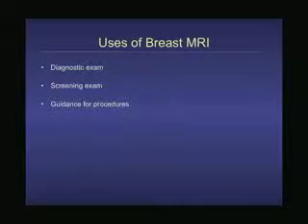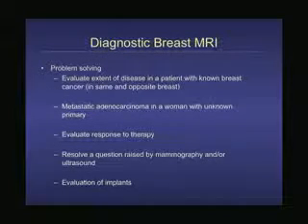So again, we use them the same ways. Number one, for diagnostic purposes. There are some women that will do it as a screening exam, so again, no symptoms. And then we can guide for procedures as well. So problem solving is really the big indication for MRI. We evaluate extent of disease.